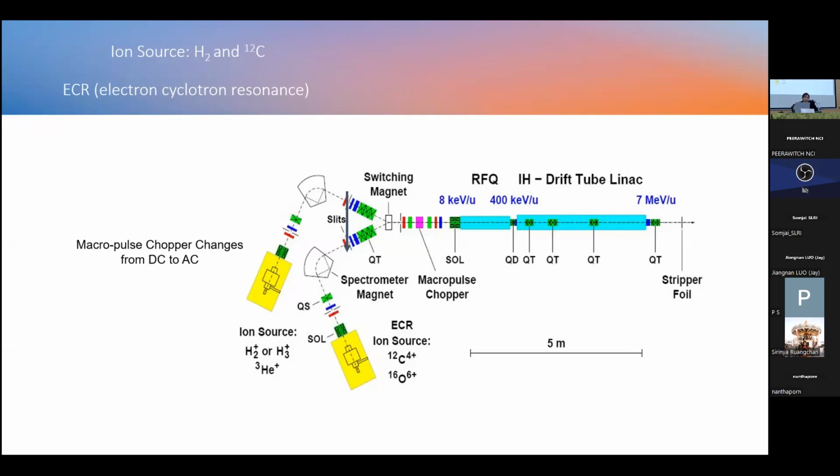For protons, some systems have, this is a totally different one, this is for carbon, but for protons, first you'd have what we call the initial stage of the accelerator. Maybe it goes up to 3.5 mega electron volts. And then you could use that to inject straight into the synchrotron. Or you could have an additional RFQ, radio frequency quadrupole LINAC, that accelerates to a little bit higher energy, for example, 7 mega electron volts, and then goes into the synchrotron.